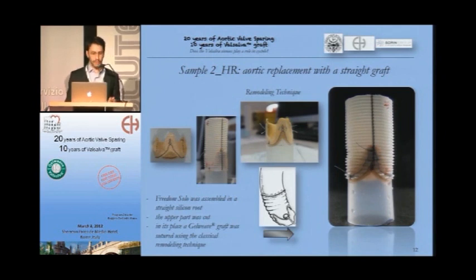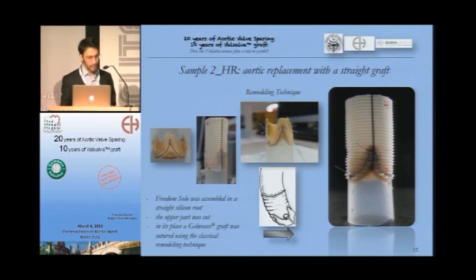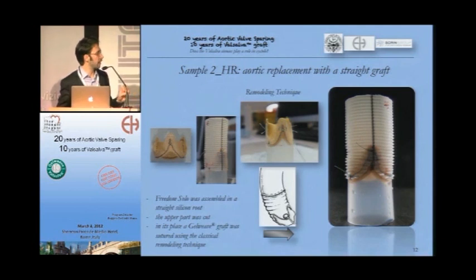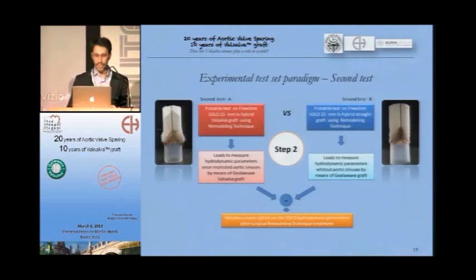Also in this case, we followed the same steps. The Freedom Solo was assembled in a straight silicon root. The upper part was cut, and here a Gelweave graft was sutured using the classical remodeling technique.